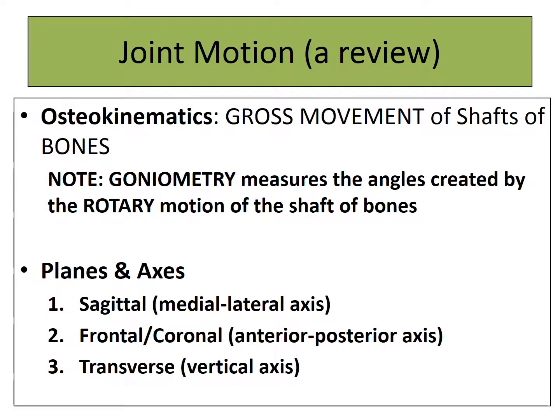But when we talk about range of motion, we are going to be measuring osteokinematics. And you see there on the slide too, we can measure range in the sagittal, frontal, or transverse plane. So just to give an example, if we take the shoulder, the sagittal will be measuring shoulder flexion, the frontal will be measuring abduction, and the transverse could be internal and external rotation.